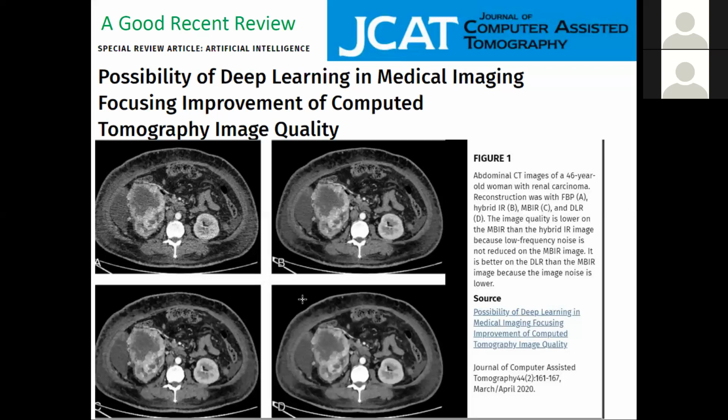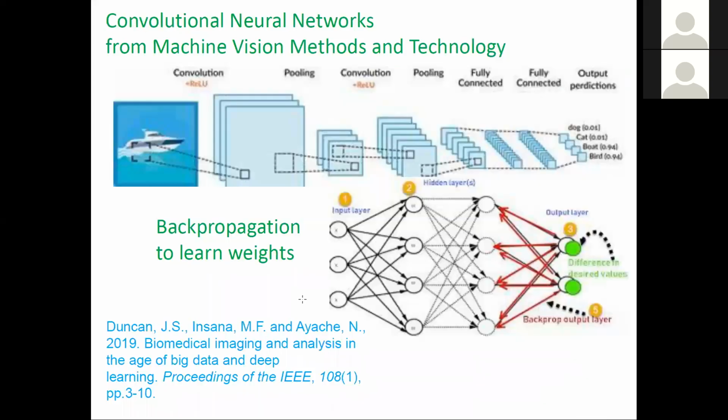The modeling comes about ultimately, and can often come around from your statistical noise, your actual quantum noise in the number of X-rays detected along that line of response. That's what your regularizers keep adding. But okay, anyway, these neural nets all came about from developments in machine vision, and part of that made this schematic that you'll see again and again. That's the UNet, which is a particular type of convolutional neural net.